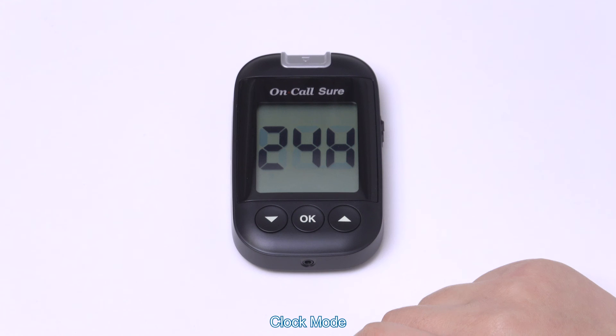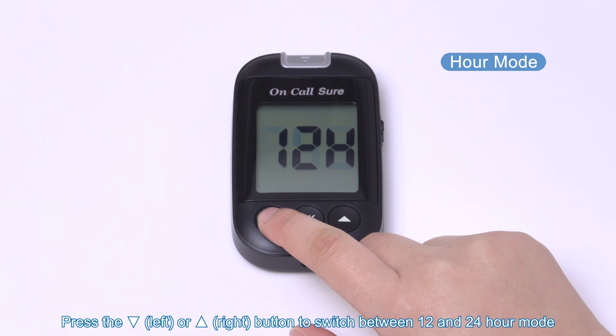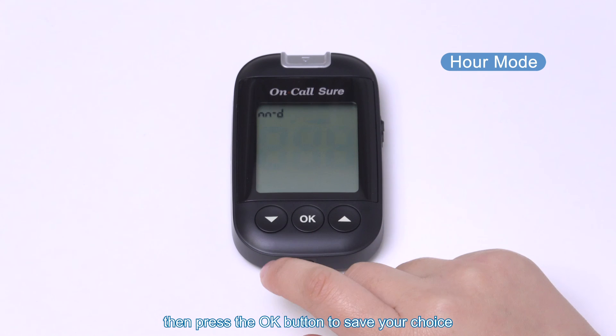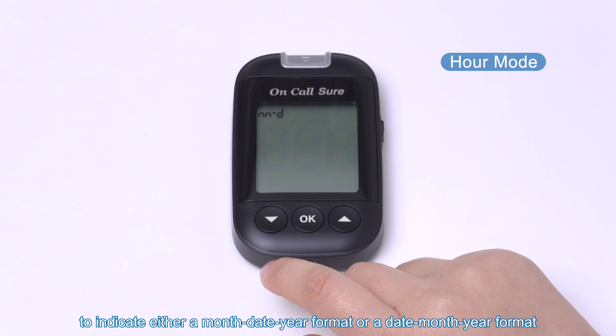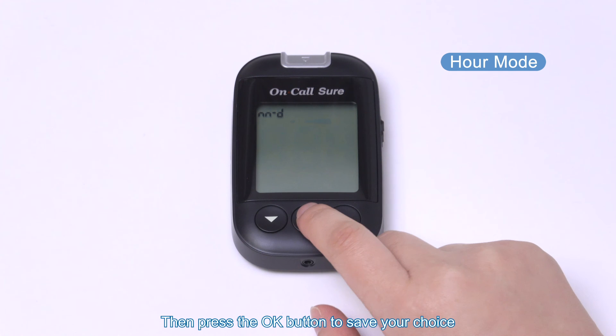Clock mode: press the left or right button to switch between 12 and 24 hour mode, then press the OK button to save your choice. Date format: M-D (month-date-year) or D-M (date-month-year) will appear at the top of the display. Press the left or right button to switch between the two settings, then press the OK button to save your choice.